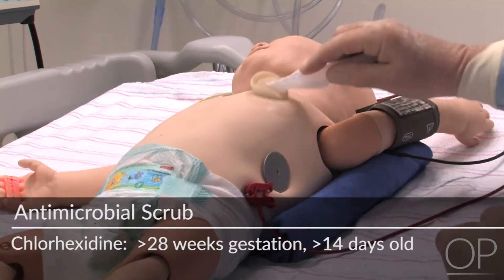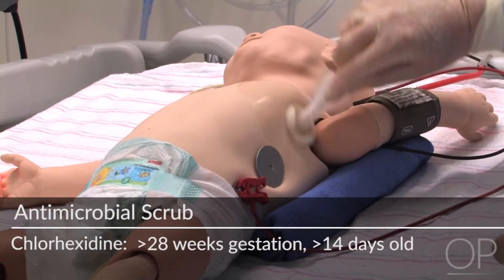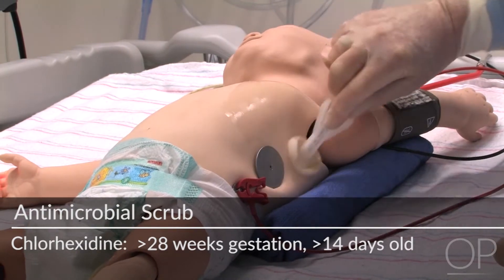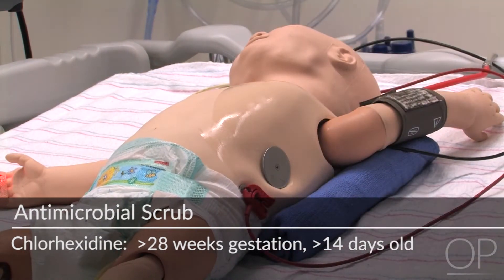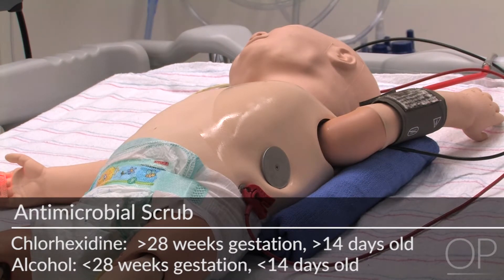Prepare the surgical area with chlorhexidine if the infant is greater than 28 weeks gestation or if greater than 14 days old. Use alcohol if the infant is less than 28 weeks gestation or if less than 14 days old.